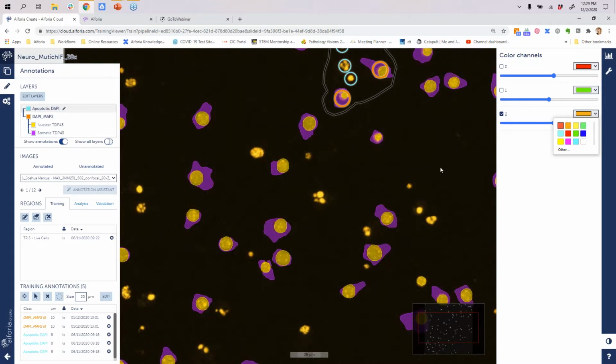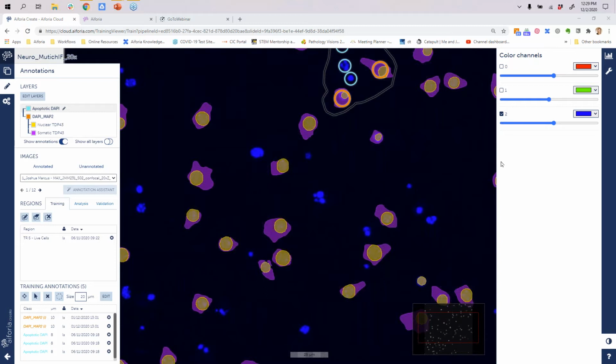Great, thanks, Lindsay. So I'm conscious of time, so let's take on one more question. This one's a little more general. And the question is, typically, how many images will it take to train an AI model with Aiforia? Right, so not many. So it takes about 10 to 20% of your entire data set you'll use. So let's say you have 100 whole slide images in your entire data set, about 20 of those would then be used to train your AI, and about 10 for validation, if you choose to go that route.